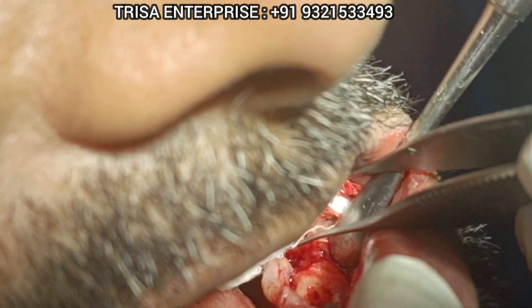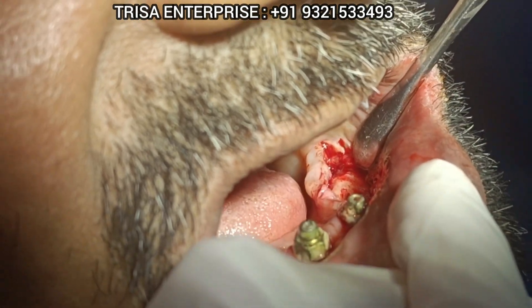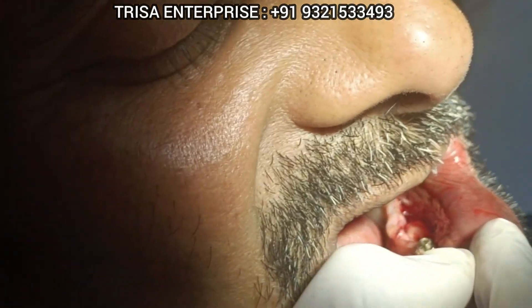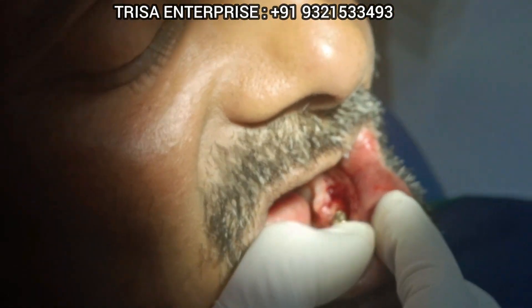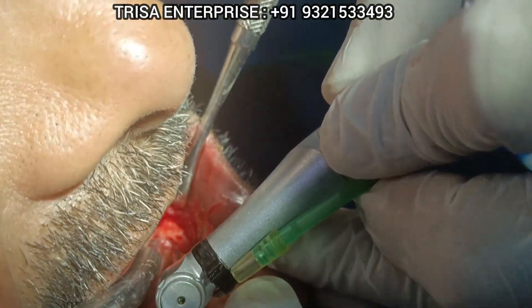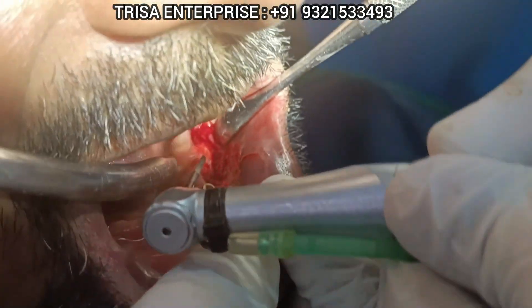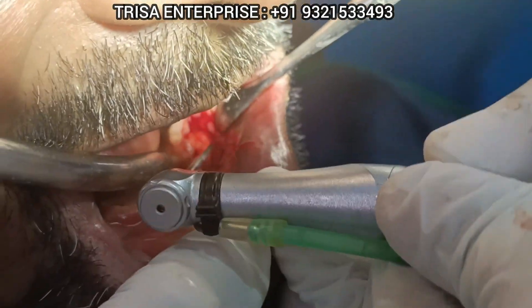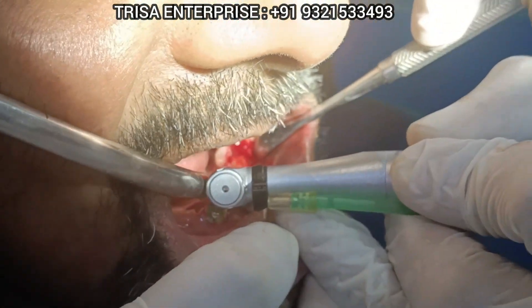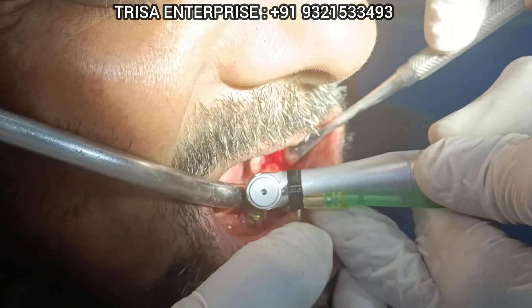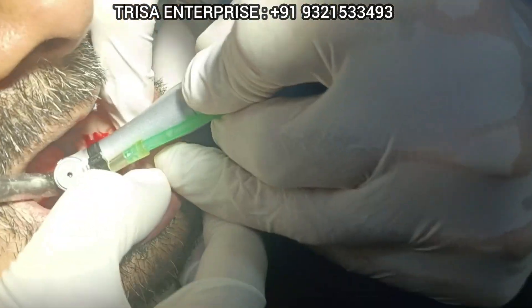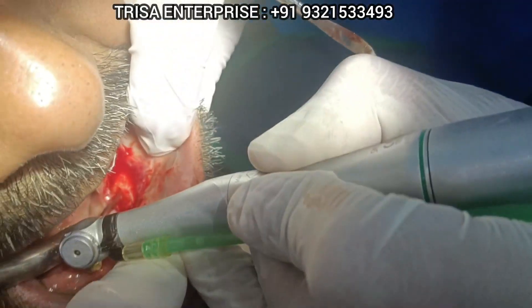So first I am creating my lance drill. This is my lance drill, and I'm going to go not only buccal-lingual to buccal, but also slightly distally — like this.